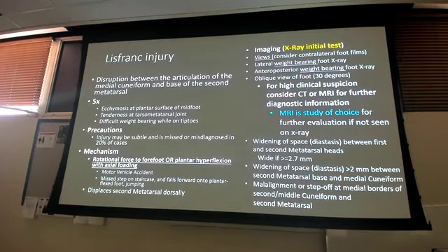Okay. Very few things in the lower extremity we have talked about have been super important, must know, and testable. Lisfranc is one of them. Okay? This is an injury from disruption between the medial cuneiform and the second metatarsal. We're going to take a look at what the pictures look like. Typically, we get rotational force of the forefoot or plantar hyperflexion with axial loading. Right? Plantar hyperflexion with axial loading.